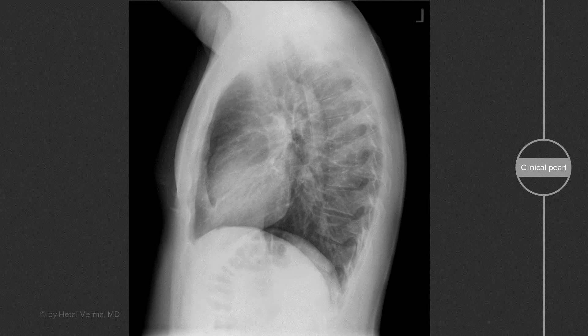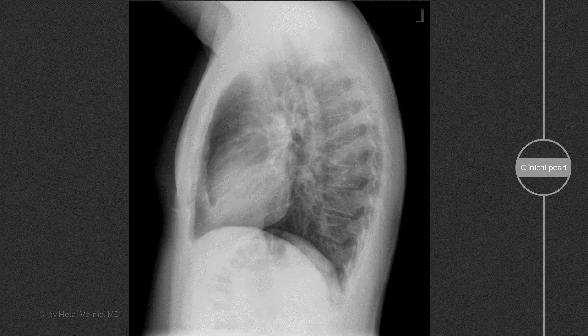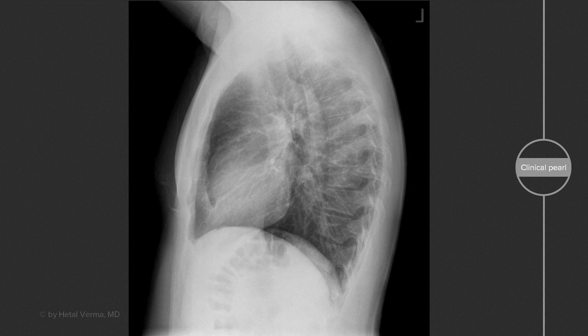So how about on a lateral view? Again, it's important to have both a frontal and a lateral view whenever possible. However, a lateral view is almost never performed alone.